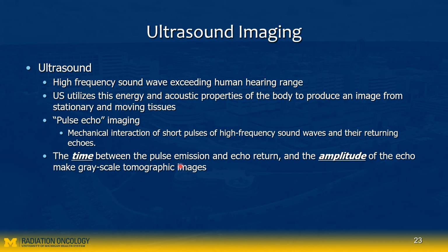How fast or how late the sound comes back, and how strong it comes back, tells what's behind the boundary. That's how ultrasound images are created.